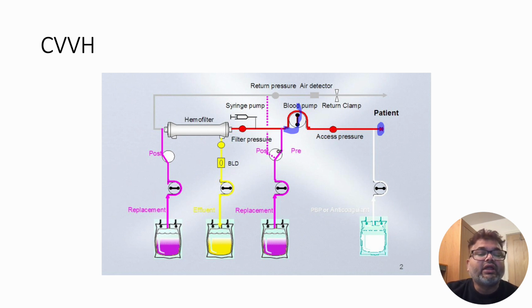Another pink diagram here is actually post filter replacement. So you can dilute or you can put the solvent either pre-filter or post-filter, which will go to the patient and come back.